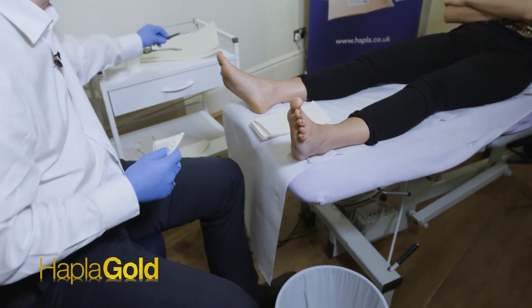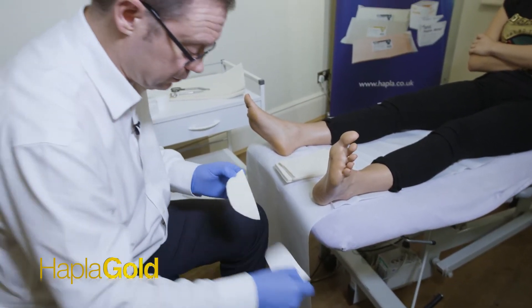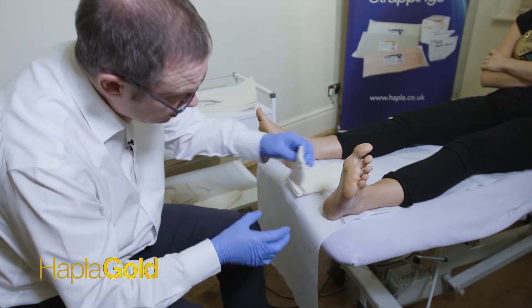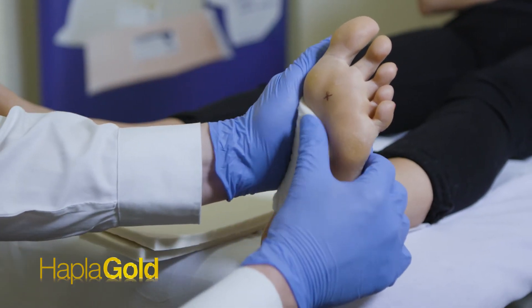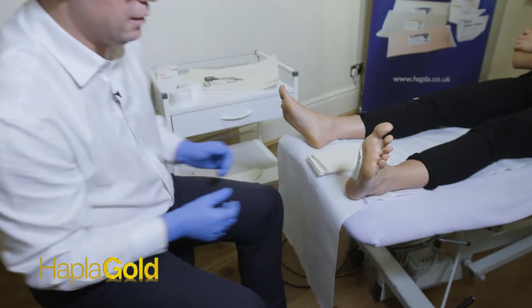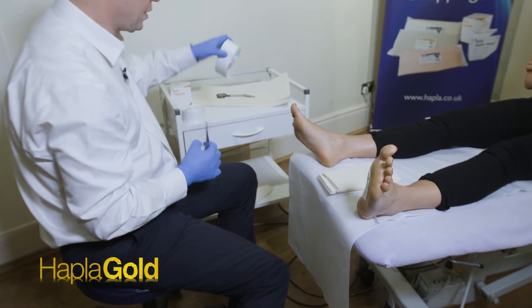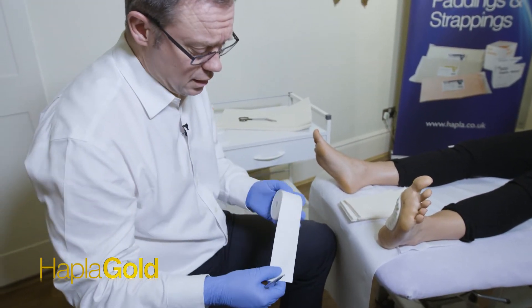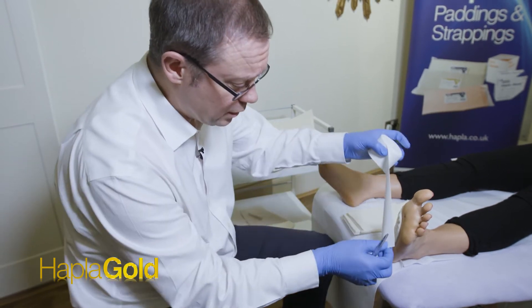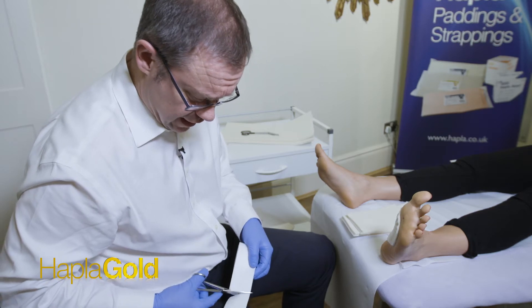The pad is ready to apply now. I'll peel off the paper back and site it within the arch area of the foot. Now to hold this in place and stop it from moving, and so to reduce friction on the skin, we apply Chirofix retentive strapping which we will overlie over the pad to stick it down.